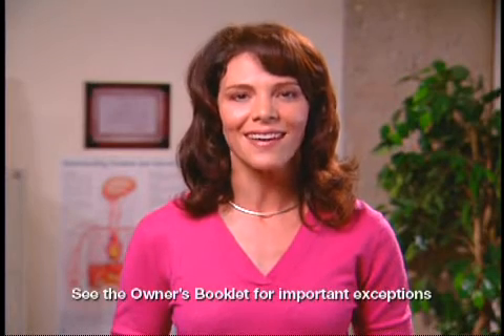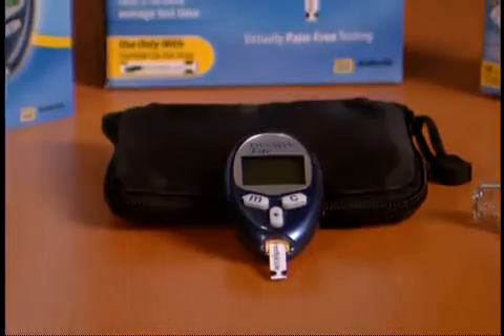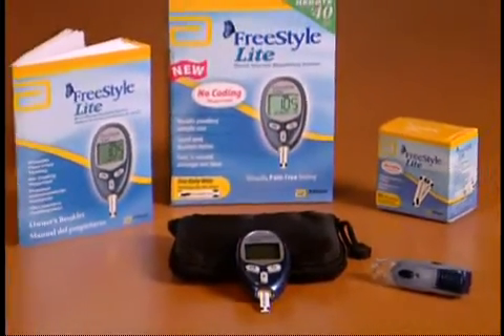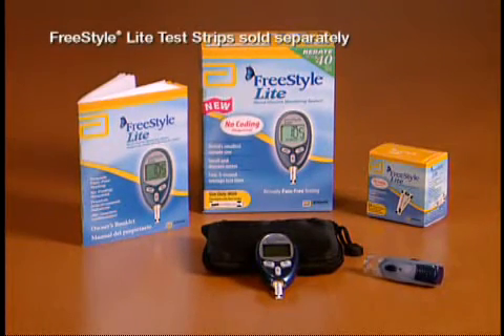The FreeStyle Lite Blood Glucose Monitoring System is designed to make it easy for busy people to test whenever they need to. The system includes the FreeStyle Lite Meter, a lancing device and lancets, an owner's booklet, and a small, easy-to-take-anywhere carrying case. During the next few minutes, I will guide you through each of the steps you'll need to take when you test your blood glucose level.